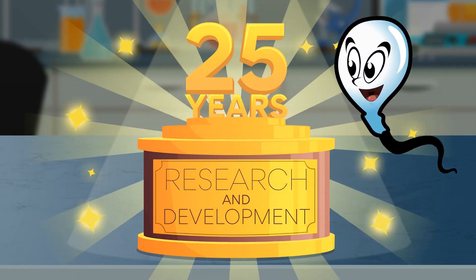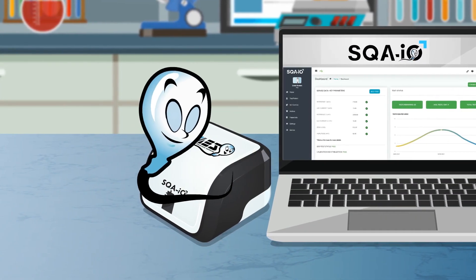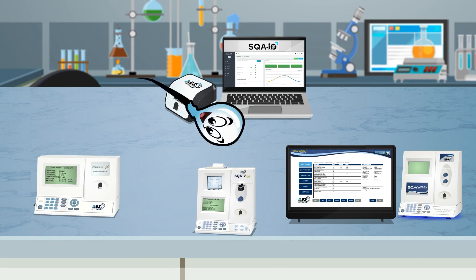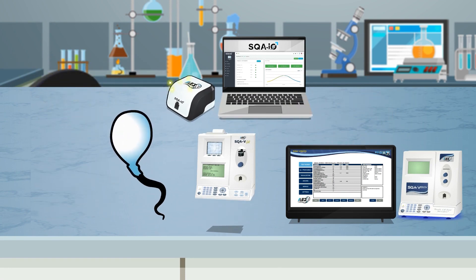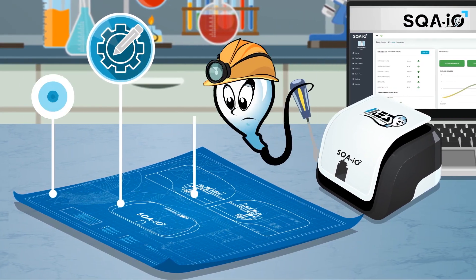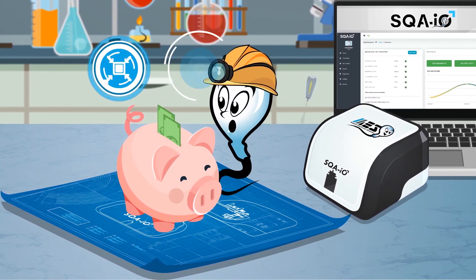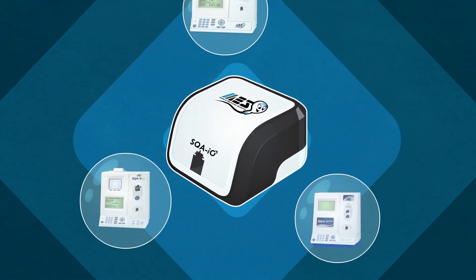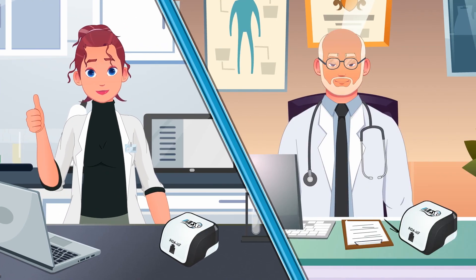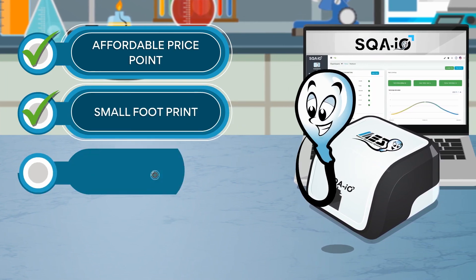Harnessing 25 years of research and development expertise, Medical Electronic Systems created the SQAIO Automated Sperm Quality Analyzer. The system is a modern evolution of MES's current instrument lineup, which includes the QuickCheck Gold, SQA-V, and SQA Vision. Designed from scratch to address the expanding need for rapid and accurate male fertility testing, the SQAIO is an affordable, compact, and easy-to-use device combining the most important features of its predecessors, with an efficient design for lower-volume labs and doctors' offices needing an automated solution with an affordable price point, small footprint, and simple operation.